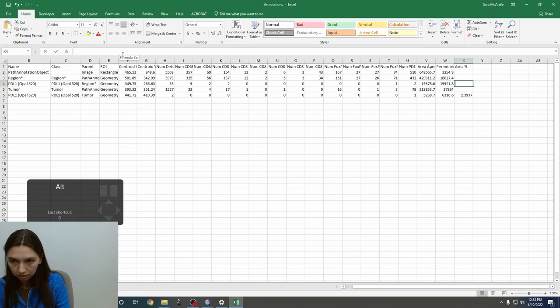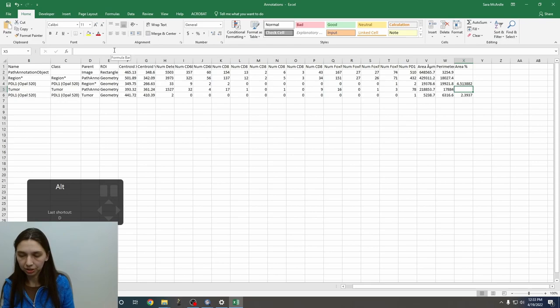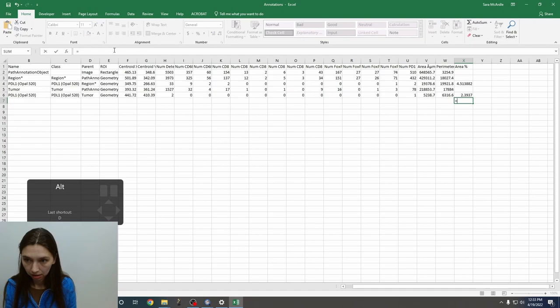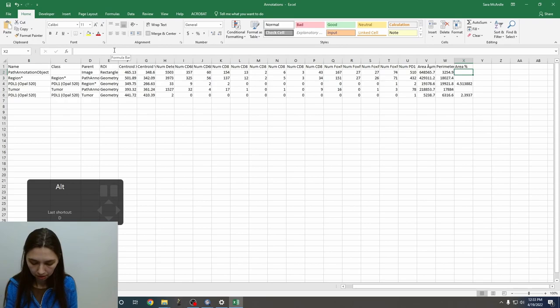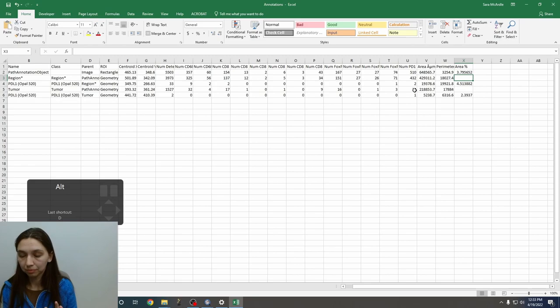And 4.5% of the other tissue is PD-L1. Or you can say here, I'm going to add up the two PD-L1 regions overall, both PD-L1s divided by the full slide annotation. It's here. That's 100, should be about 3%. Yep. In total, about 3.8% of the whole image was PD-L1.